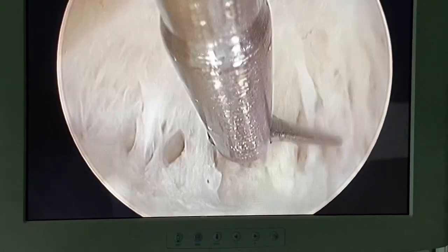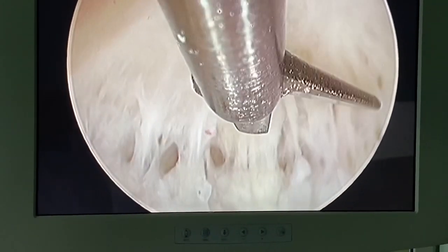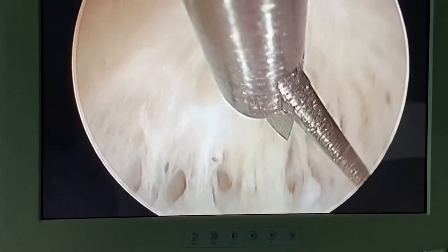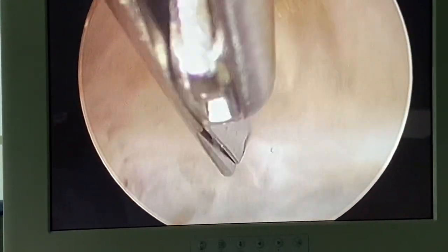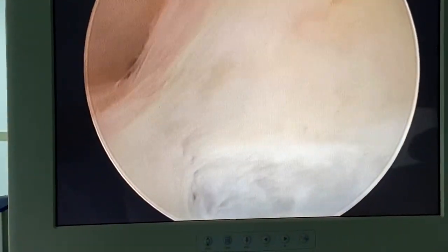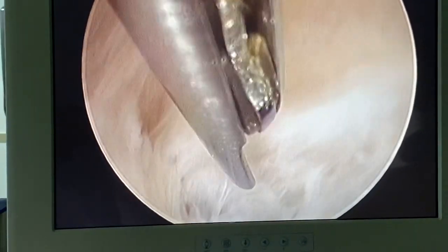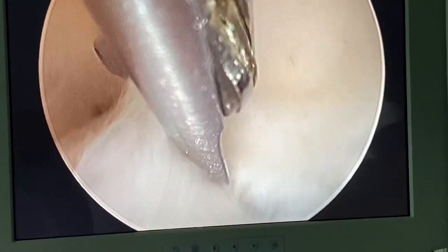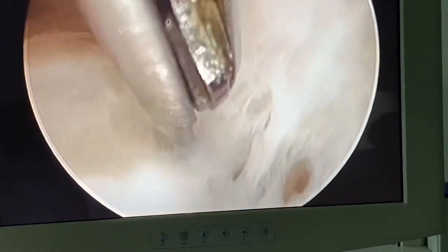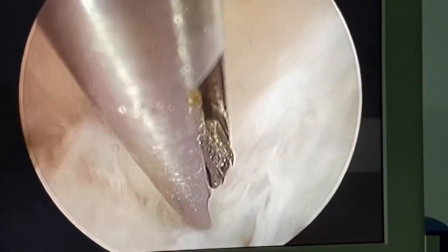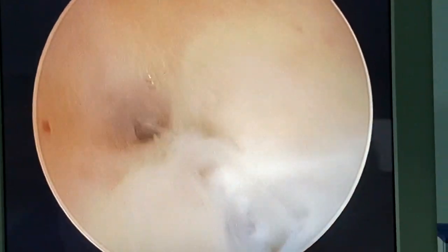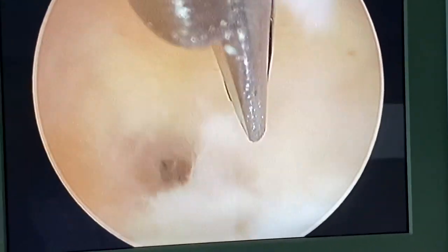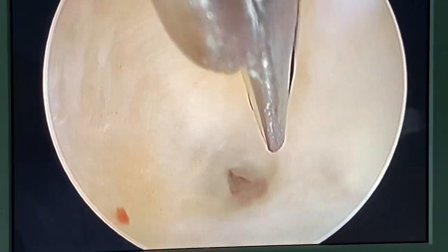This is the rotation of the scissor, and this is the rotation of the whole system. There are some adhesions here — I will just move like this. I'm not cutting. You remember that tube was covered by a membrane — it's nice now.